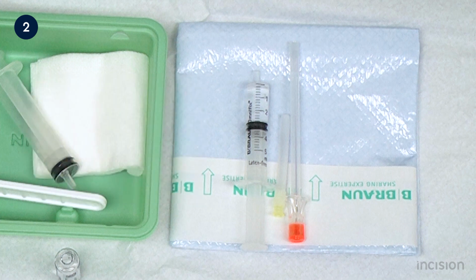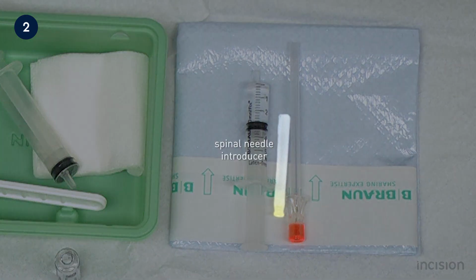Returning to the sterile pack, take note of the spinal needle introducer, used to support the passage of a spinal needle through the skin and soft tissue. Pencil point spinal needles, which have a blunt tip, always require the use of an introducer.